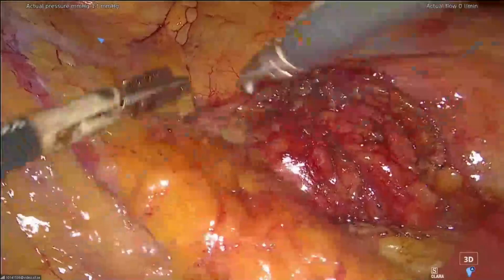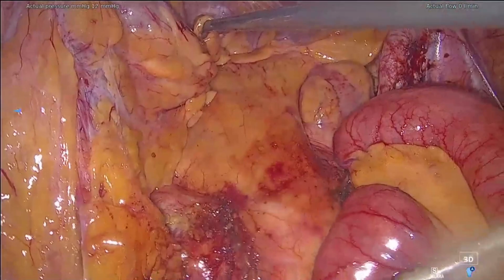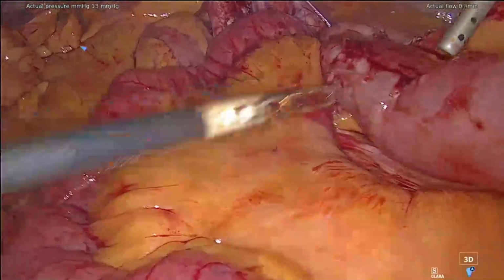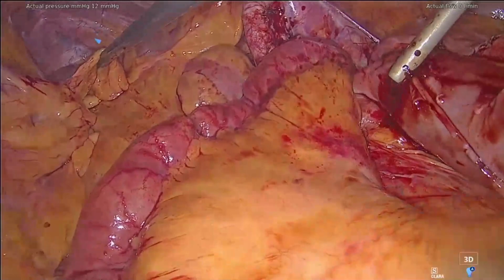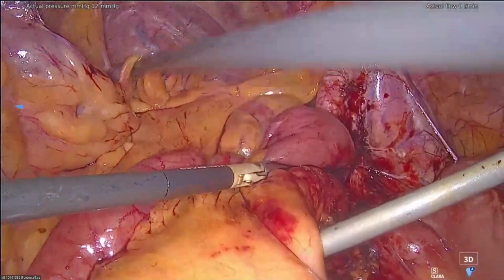The patient has a cystectomy with Bricker, and during the first procedure, the patient had a very short right ureter. Then they made a very long Bricker, and we have probably already found a part of the problem. This is the Bricker, but here we have a loop of bowel really adherent at this level. We have already started to release it, but stopped to show you the significance of the adherence. It's adherent on the iliac vessels, and it's a very bad place.